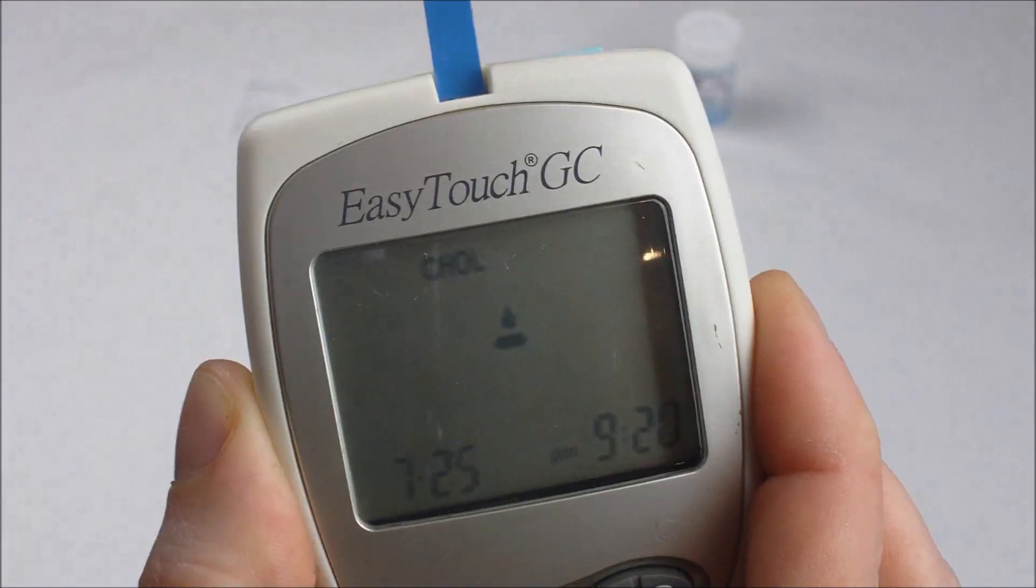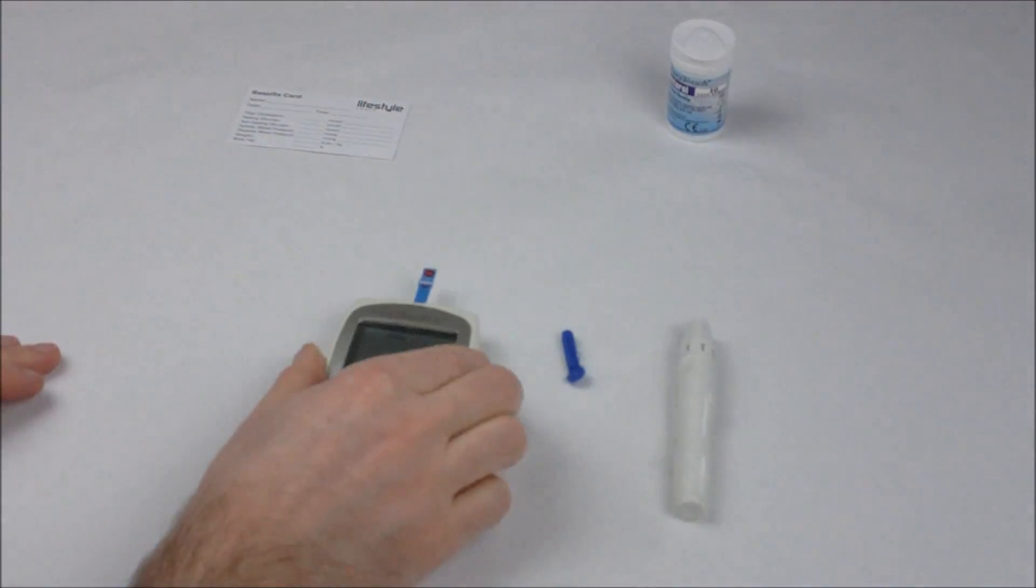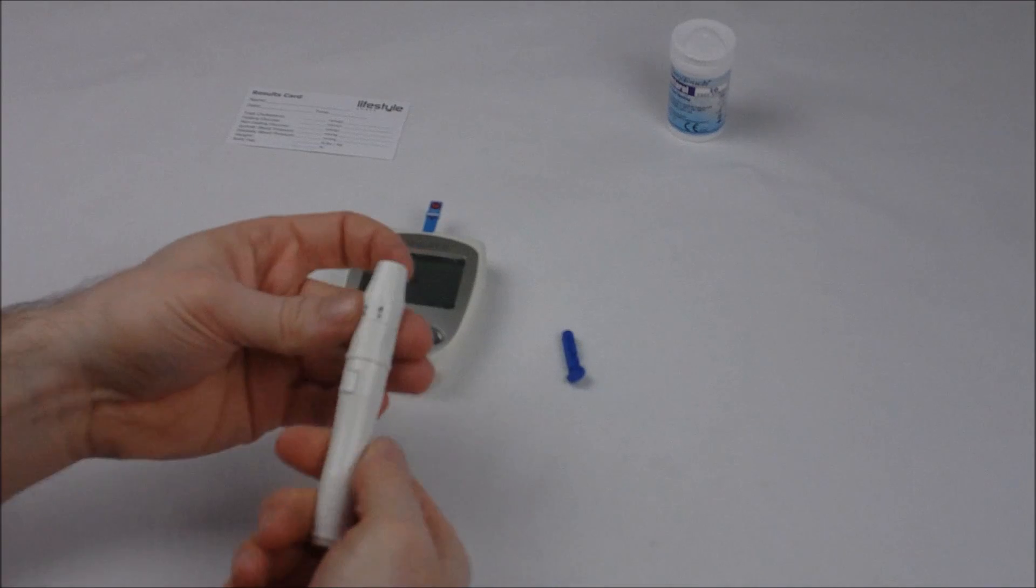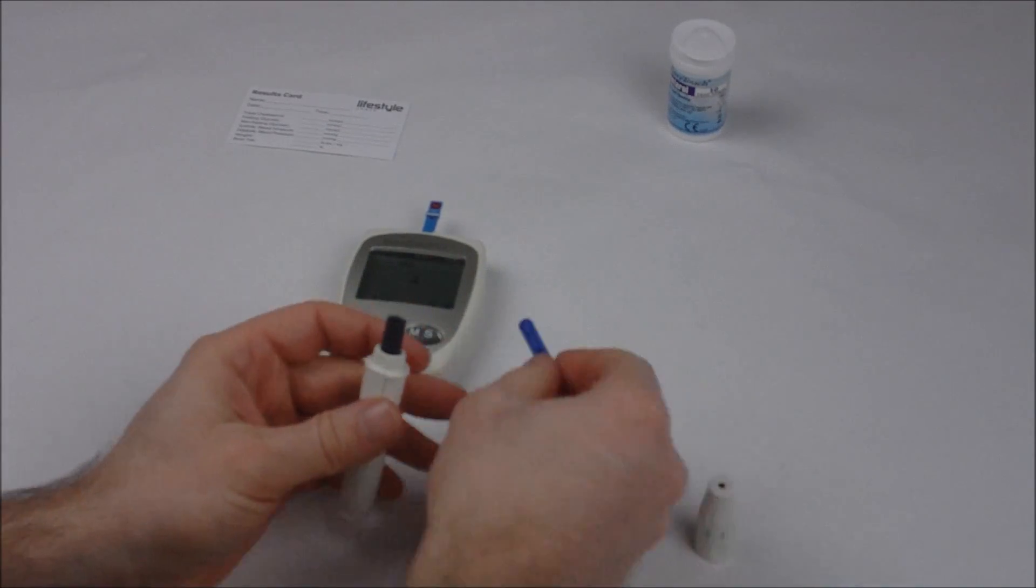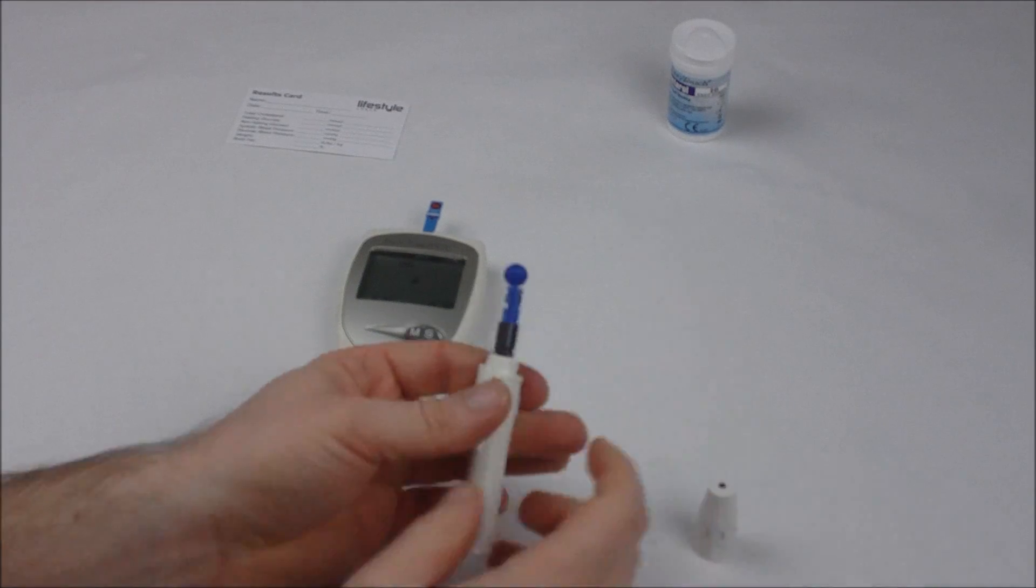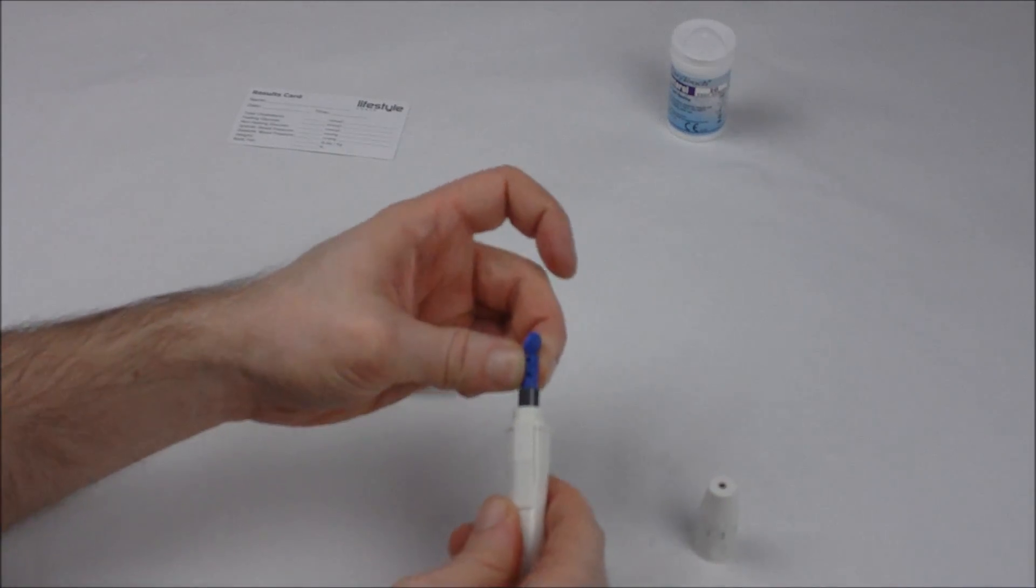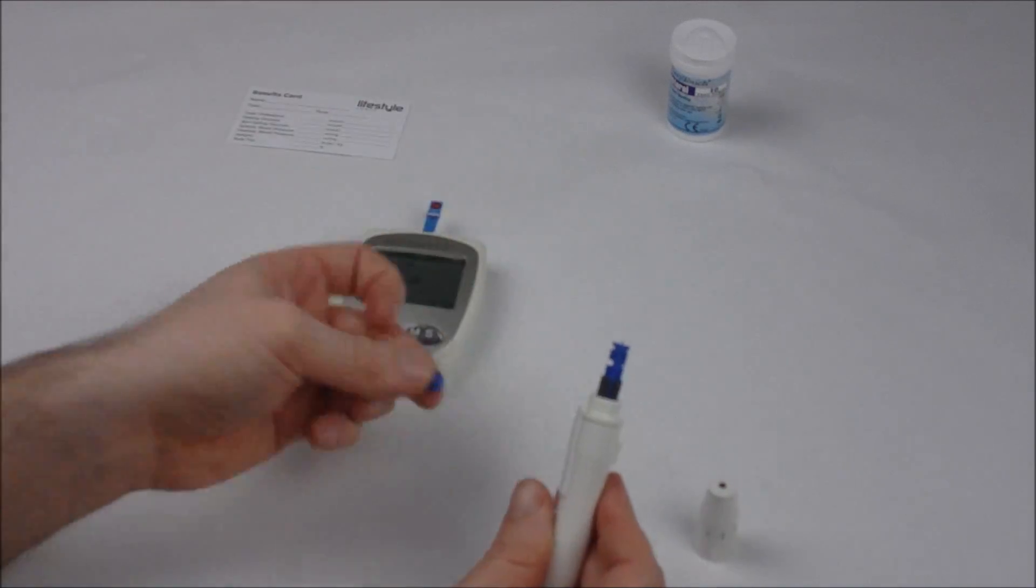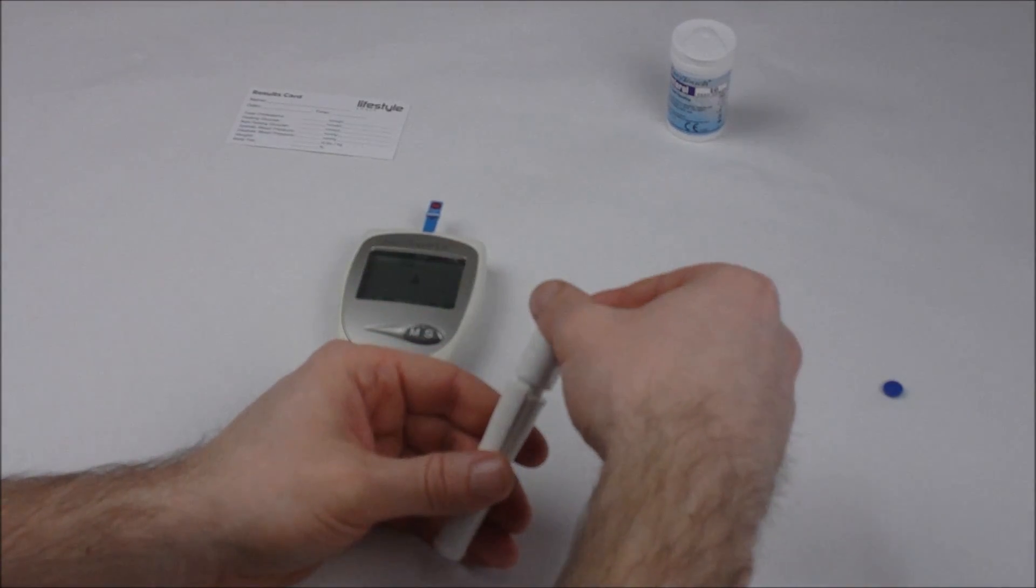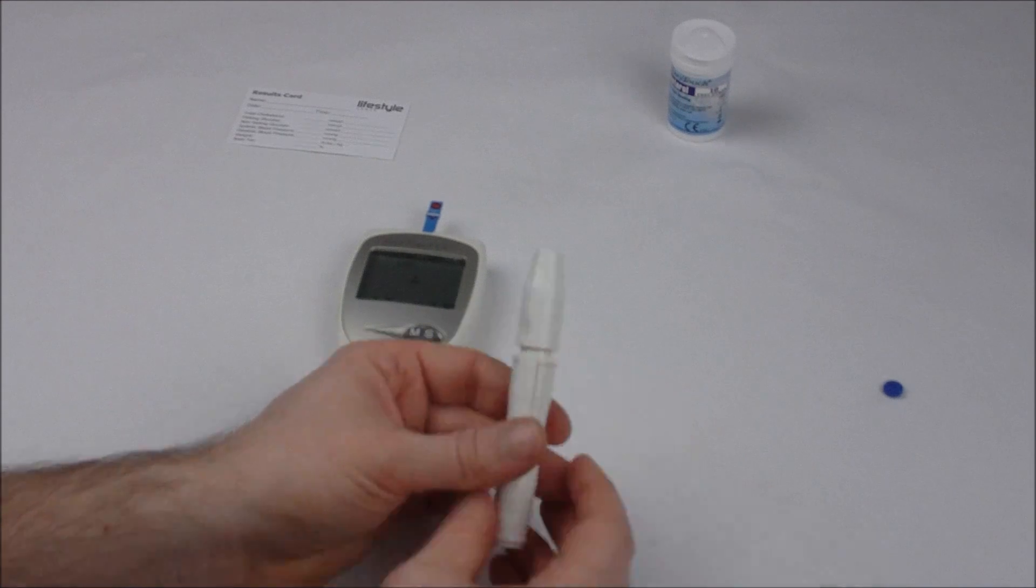When you're at this stage you're ready to go ahead and prick your finger, so make sure you've washed your hands. Unscrew your lancet pen, insert your lancet fully, twist off the cap to expose the needle, and then re-screw on the top.